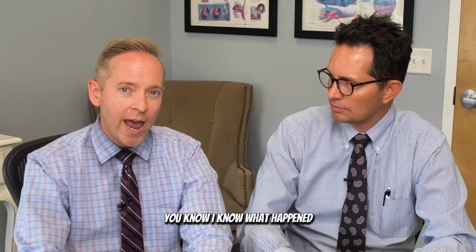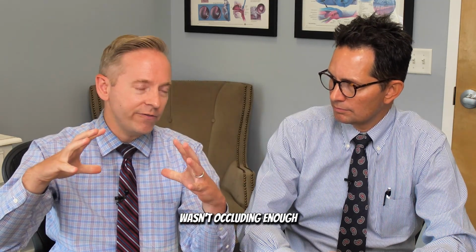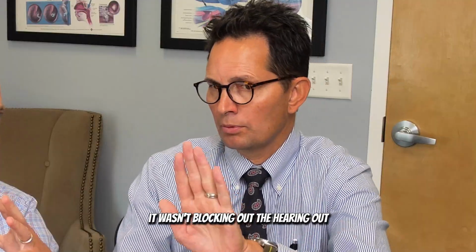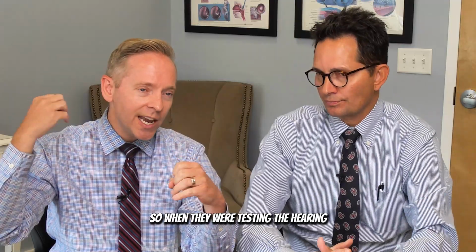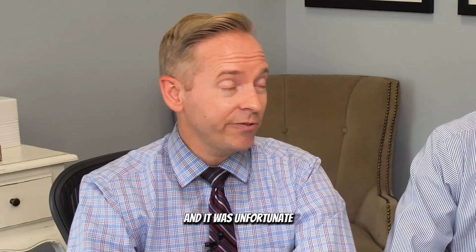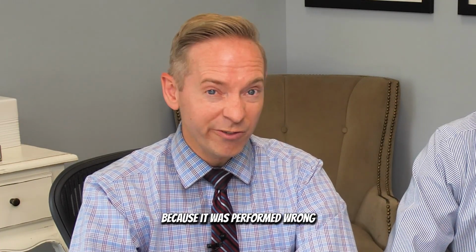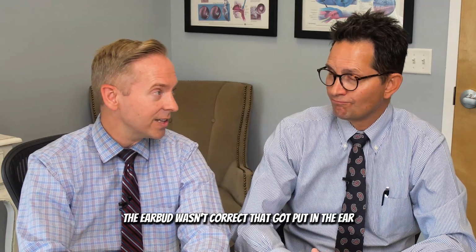And I said, you know what happened. That little earpiece that went in your ear wasn't occluding enough. It wasn't blocking out the warehouse sounds. So when they were testing the hearing, it gave a false hearing loss in those low frequencies. It was unfortunate. It was just a classic example of an inaccurate test because it was performed wrong. The earbud wasn't correct that got put in the ear.